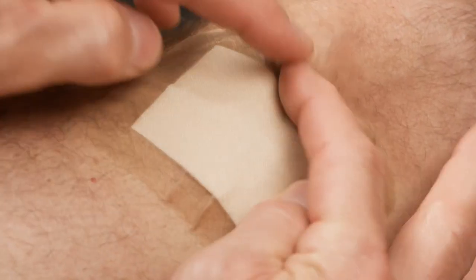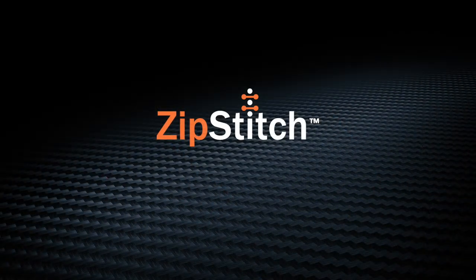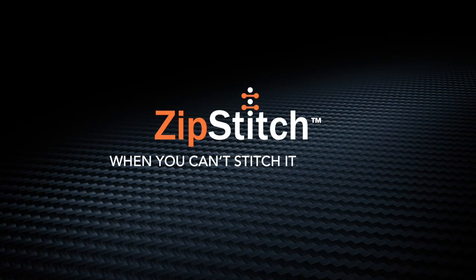Zip Stitch can be kept on the wound for up to seven days if needed. When you can't stitch it, zip it.